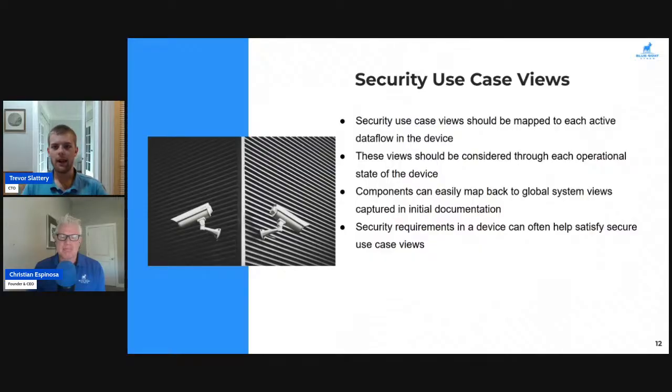When we're looking at something like that, the general rule with data flows and transfers is validation and verification on every end of the transfer. We want to verify that the information we're sending out is correct. So before it leaves and is in that active data flow state, when it's at the data store at the beginning end, we want to verify on the receiving end that we are receiving what we expect to see. This is the proper information that we should be capturing. It hasn't been modified in transit.